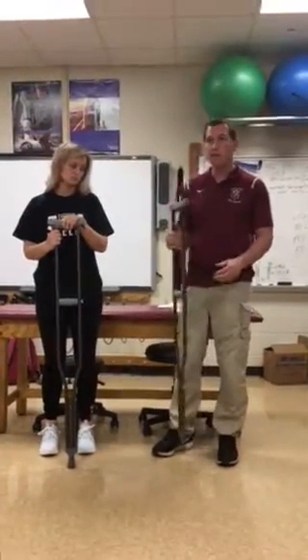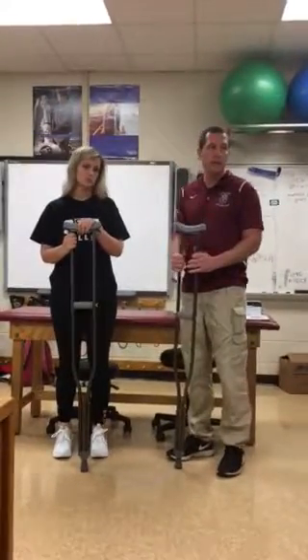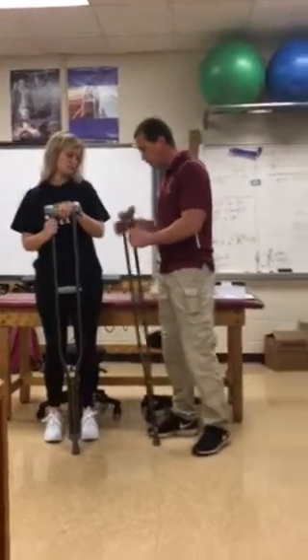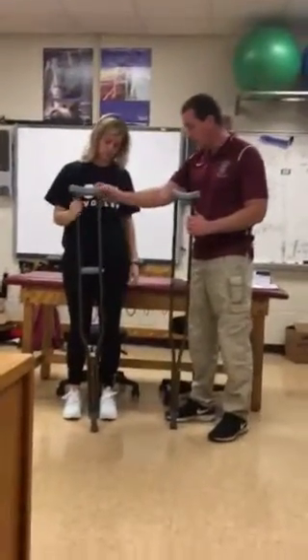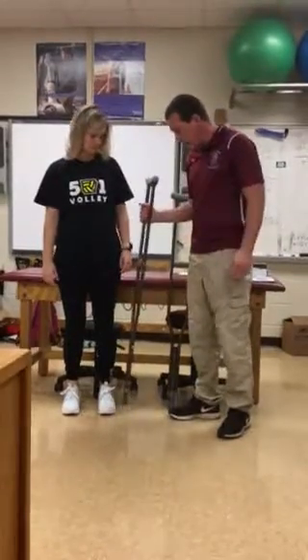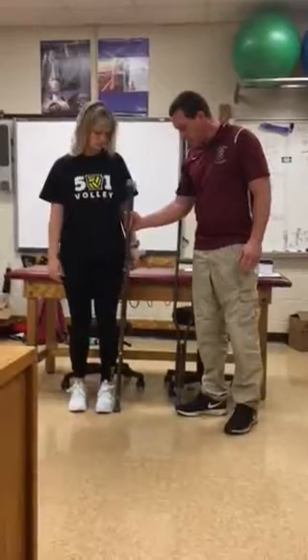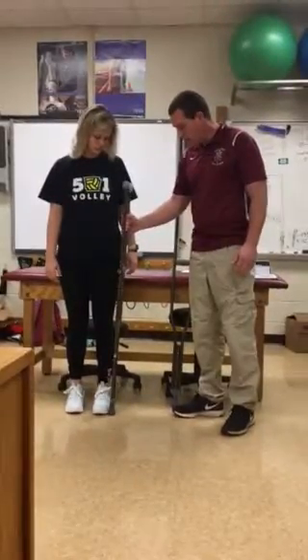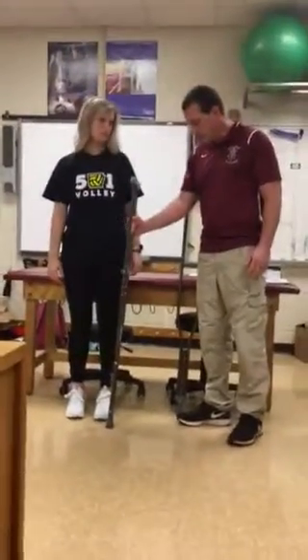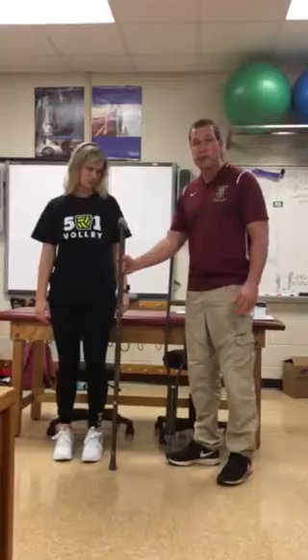So theoretically, this is going to put her in the right position. It doesn't always work out that way, so this is why you have to actually put it on them to try it. I've already got this crutch ready to the right setting, but what I want you to do is have your athlete stand up normal, and from the front of the foot, you're going to go about 3 inches in front of them, and then you're going to go 2 inches out laterally.